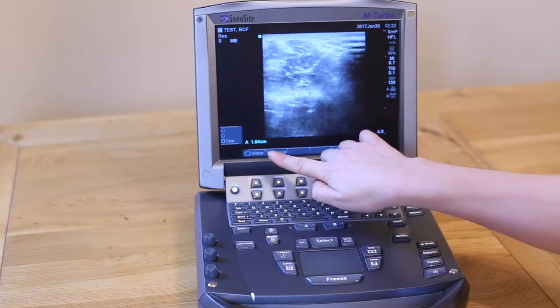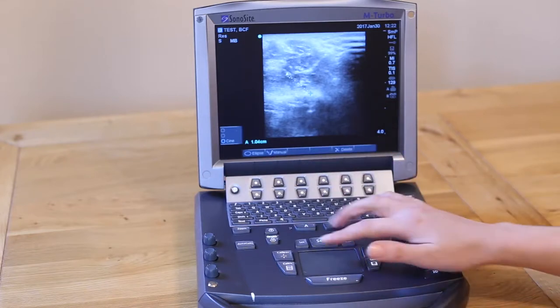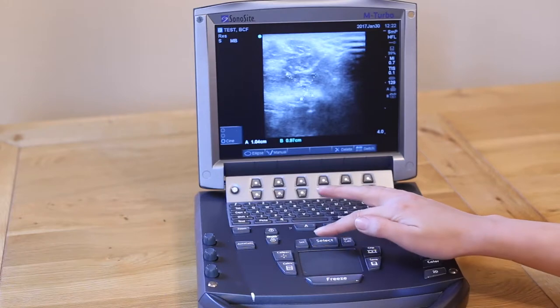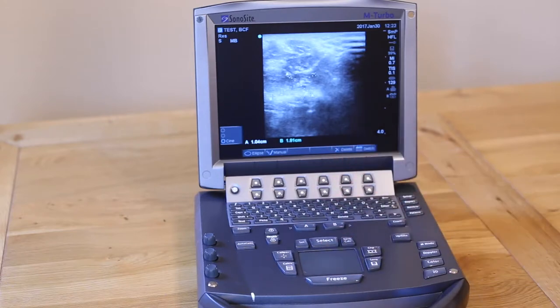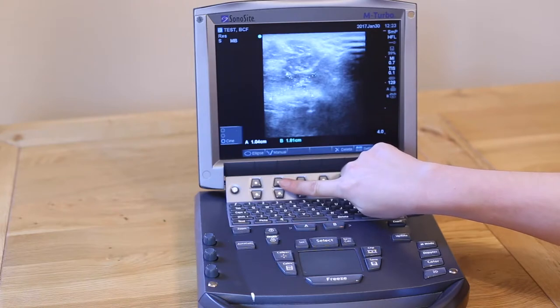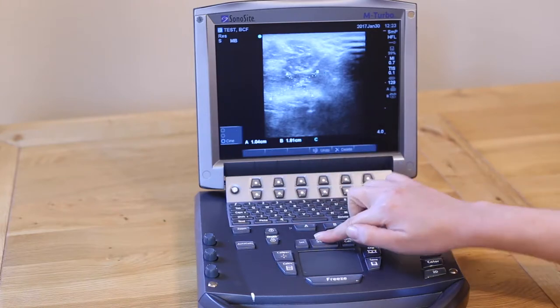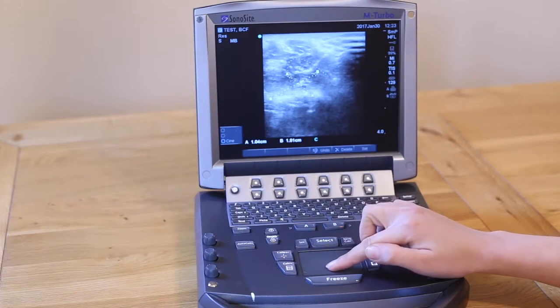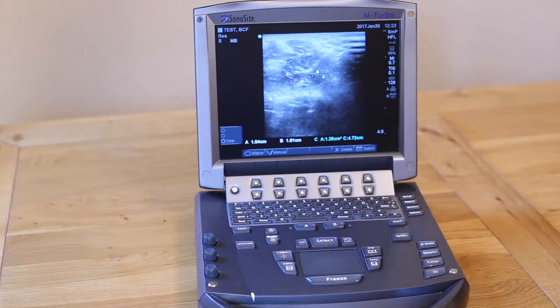A measurement is displayed on the bottom left of the screen. To add in a second measurement, simply press Caliper again. By using the soft keys on the left, you can also draw an ellipse or measure an area and circumference of a freehand shape.